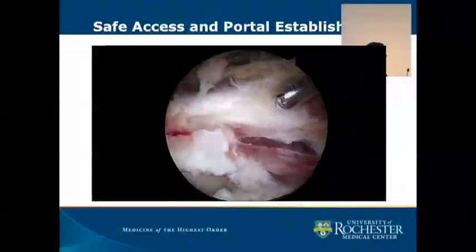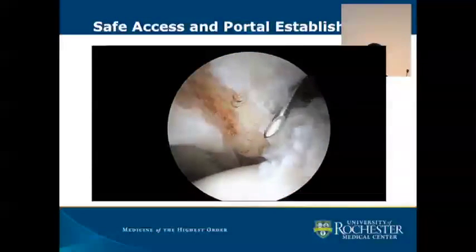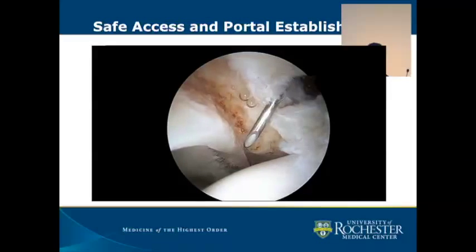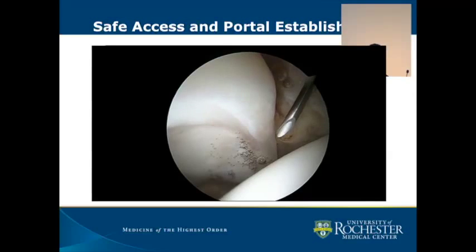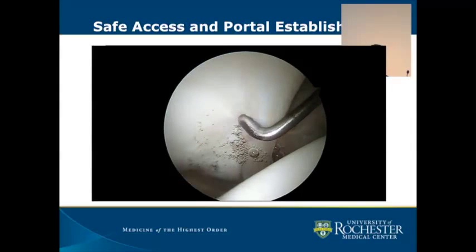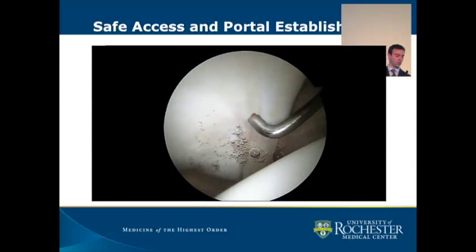This is through a direct anterior portal. I'm showing here that this would be a poor portal for placement of anchors, with a high chance of punching into the joint. And so now, with an established interportal capsulotomy and good capsular retention, you can get all the work done you need.